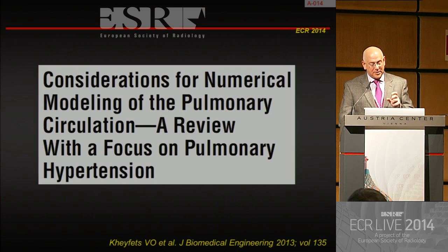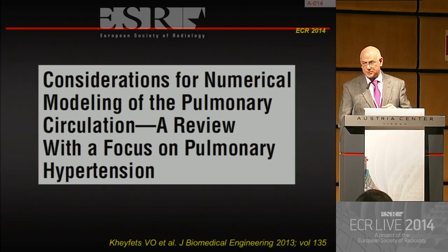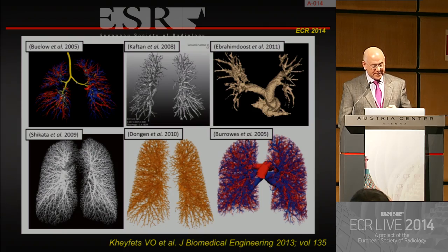There is considerable interest in the research community about the interaction between the pulmonary circulation and other physiological markers. This is just one of the very recent examples from these articles and from these research initiatives dealing with that. These are based on CT scans, our clinical CT scans. This is not like research material. This is scans we acquire every day.